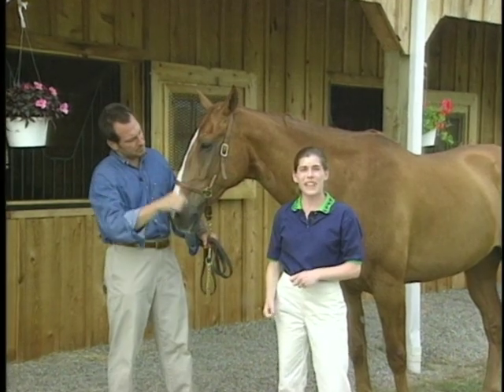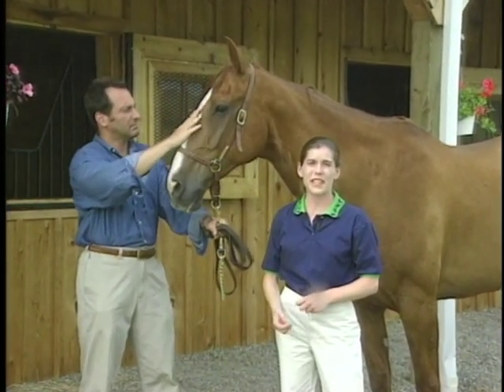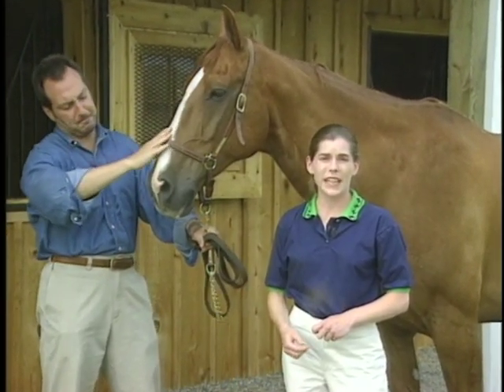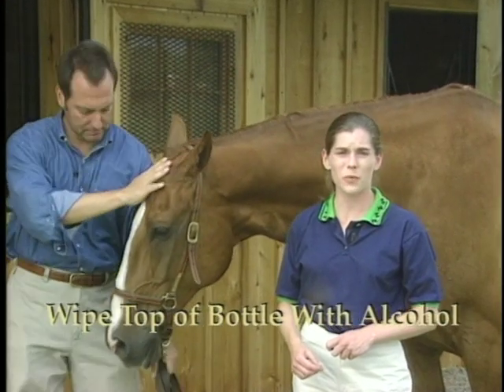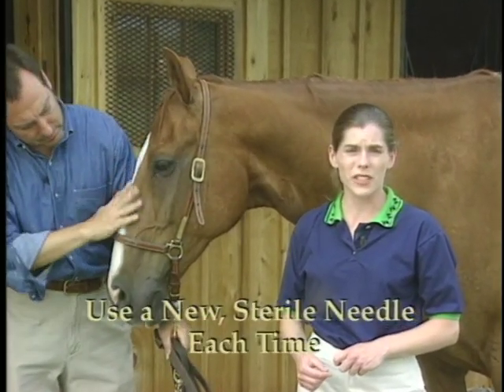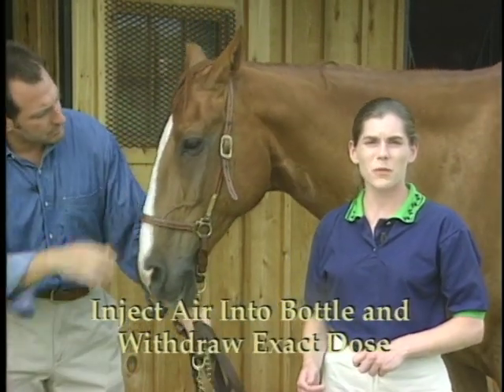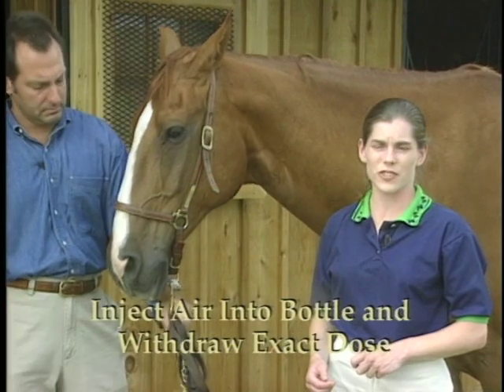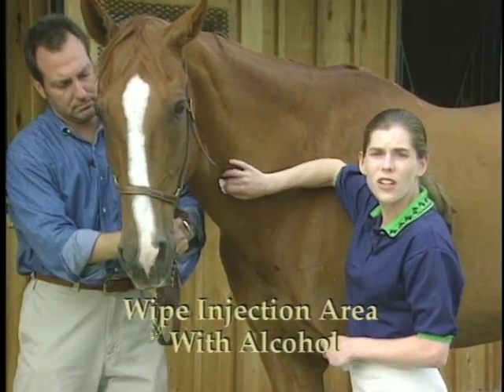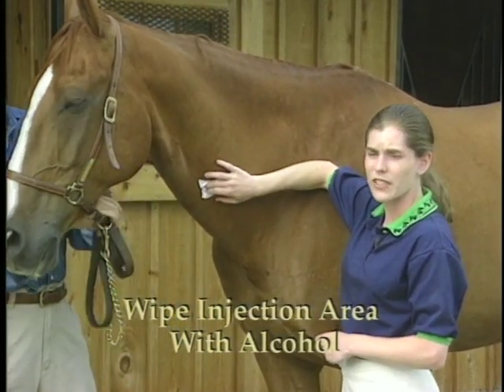You will need someone to handle the horse while the injection is being given. Twitching should not be necessary except in extreme cases. Draw up the medication sterilely. First, wipe the top of the bottles with alcohol. Then use a new sterile needle and syringe each time. Inject a small amount of air into the bottle, then withdraw the exact amount of medication needed into the syringe. Wipe the injection area with alcohol on cotton or a gauze sponge until the cotton no longer shows any dirt.